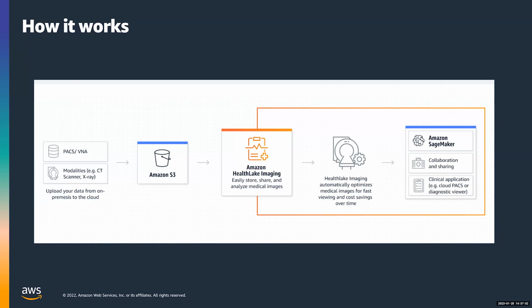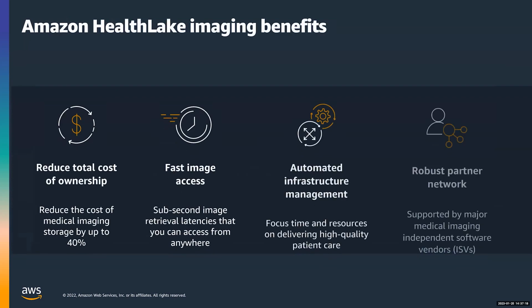Moving on, you will also have the ability to request the entire DICOM object, just as you did ingest it into Healthlake Imaging. But at that point, you can only request back your data by requesting the metadata and then requesting the pixels data in different steps.